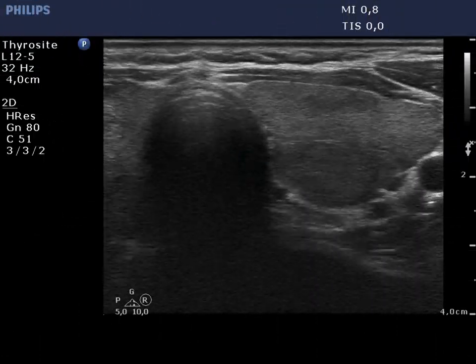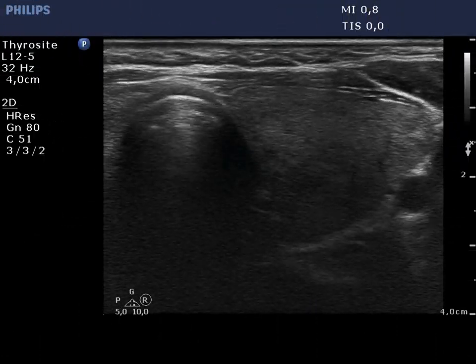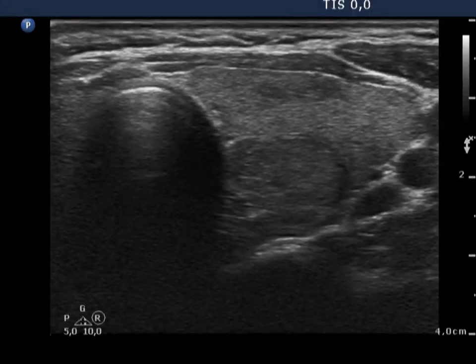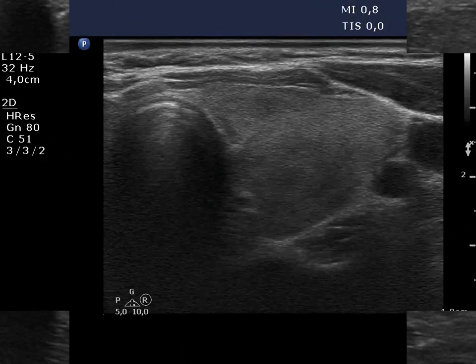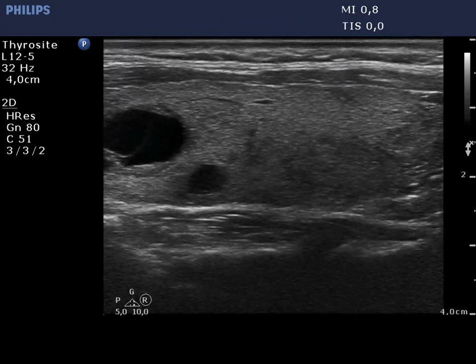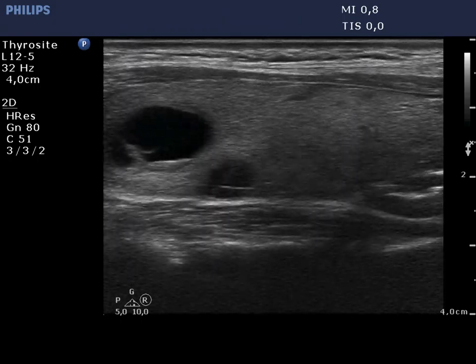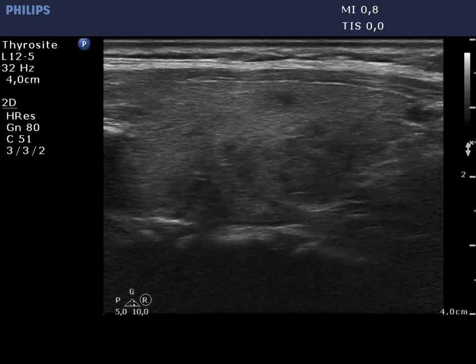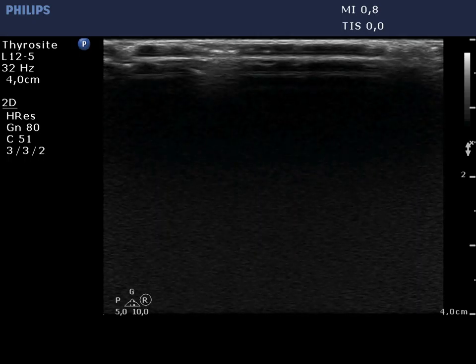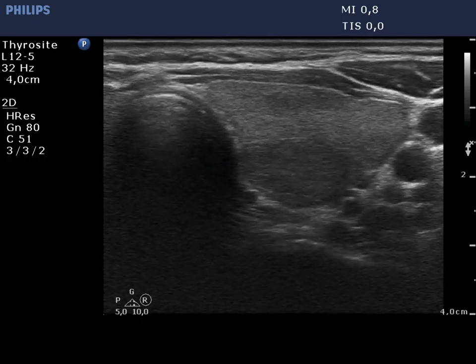There is a relatively large cystic lesion in the upper central part of the left lobe, while a moderately hypoechoic area is in the dorsal part. The cystic area is left in the longitudinal scan, while the moderately hypoechoic part is right in the video. The latter displays an irregularly increased vascular pattern.